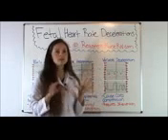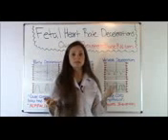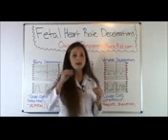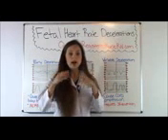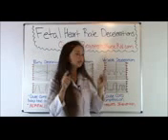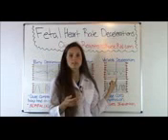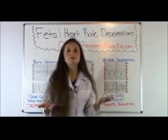So how you can remember this is a really clever way. Someone shared this with me. In order to remember variable, because the baby's heart rate is just really jumping everywhere, it's going to cause little V's. Variable starts with V, and you're going to see V's on your baby's heart rate. So that's how you can remember variable.